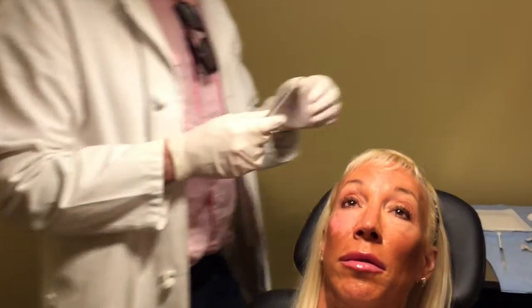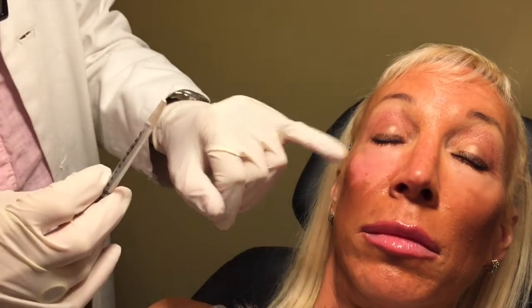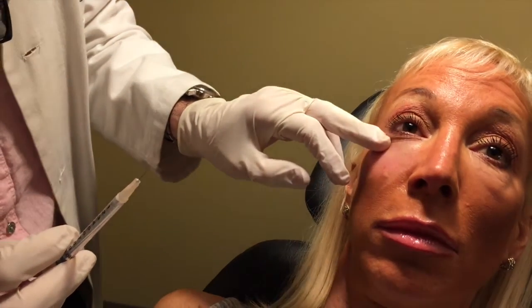And this is the area where we see it right here. Even with the light above, you can see that ridge, and that's where I think we're going to see that improve. I can almost see a little bit of the blue cast underneath the skin there. Okay, so we have our 4x4 here, and I'm going to prime our needle.